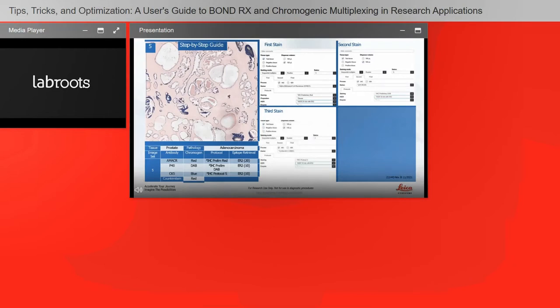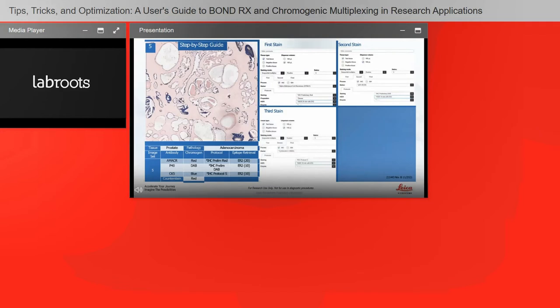Here is a prostate section also using the red counterstain. This prostatic adenocarcinoma is characterized by the loss of basal cell antigens CK5 and P40 in the ductal epithelial cells of the prostatic glands. Benign cells transform into malignant cells which express AMACR. This is evident using the three-plex technology of the Bond RX with Leica Biosystems chromogens. Non-malignant and malignant ducts are clearly differentiated by strong cytoplasmic expression of CK5 in blue, in contrast with cytoplasmic expression of AMACR detected with the red chromogen. At higher magnification, nuclear P40 expression can be seen surrounded by the CK5 blue expression, denoting benign cells.